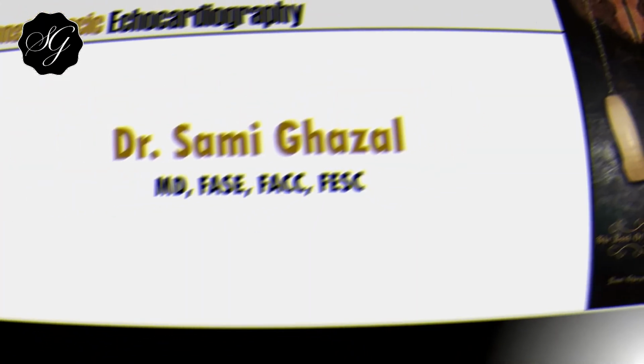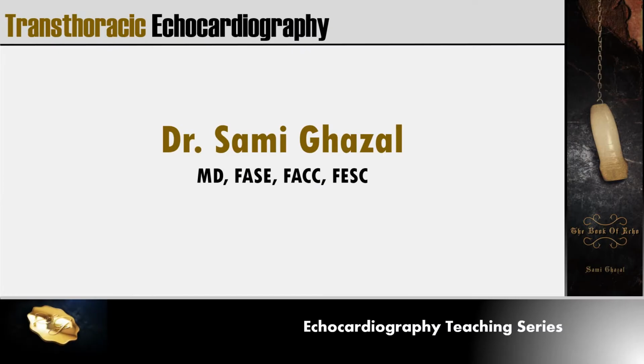Learning transthoracic echocardiography requires knowledge and skills. This lecture will provide you with the necessary knowledge. Skills are obtained with practice. So let's begin. This is part 1 lecture of transthoracic echocardiography, where we're going to discuss probe maneuvering, the basic windows and views.